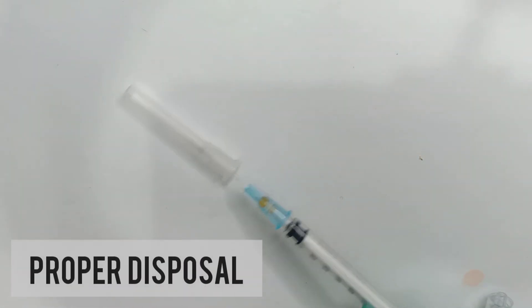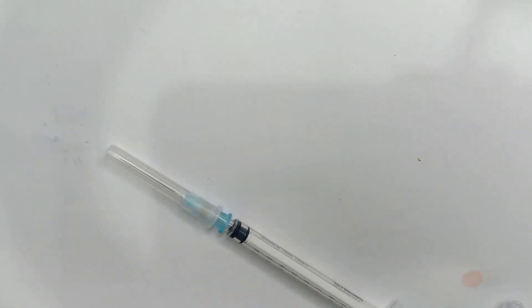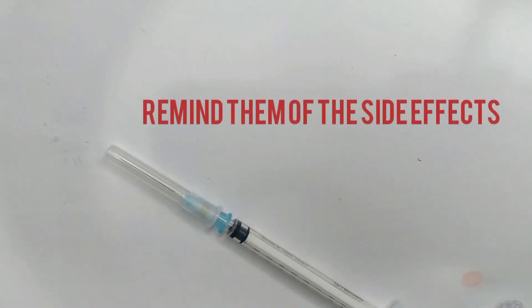Close the needle with a cover and properly dispose the materials that were used. Thank the patient and the mother, and remind them of the normal pain on the injection site and also for possible infection.